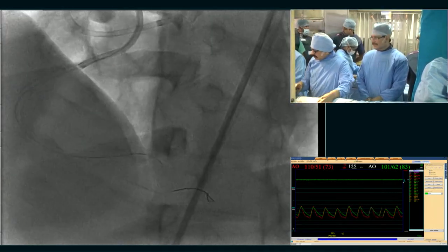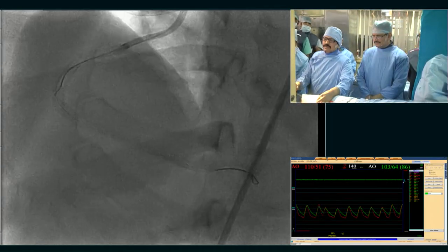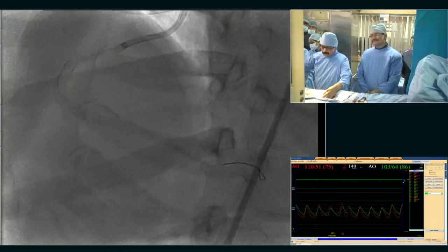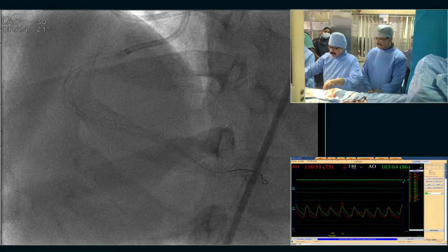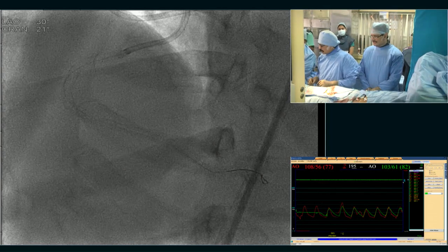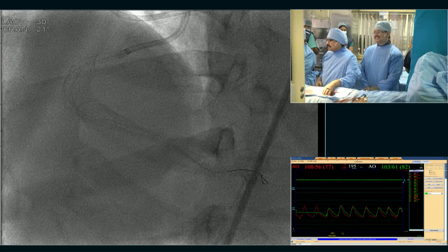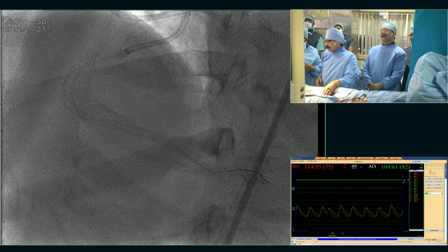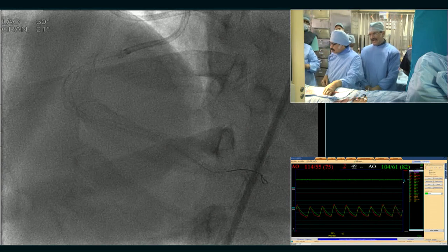Is it PLV? Whisper wire, we took 3.5. I'm removing the whisper wire. We have some suggestion from the room. Please go ahead. You remove the wire, no? I removed it. I am not interested because I know it's a three-layered stent there, and I may not achieve it, and I don't want to spoil the main stent's ISR.